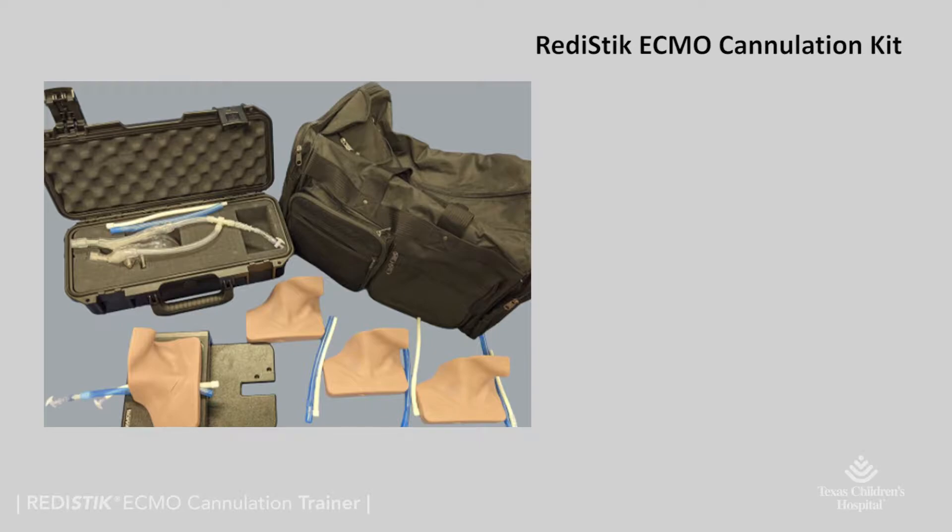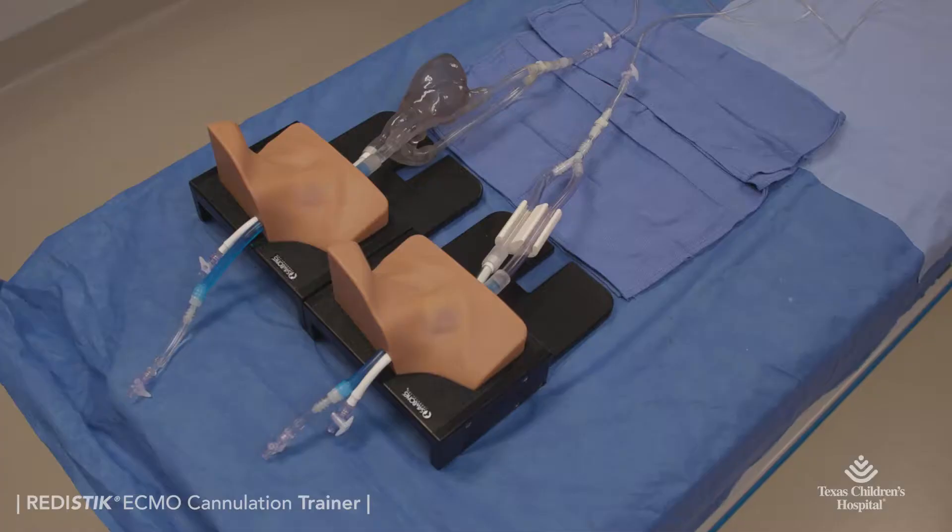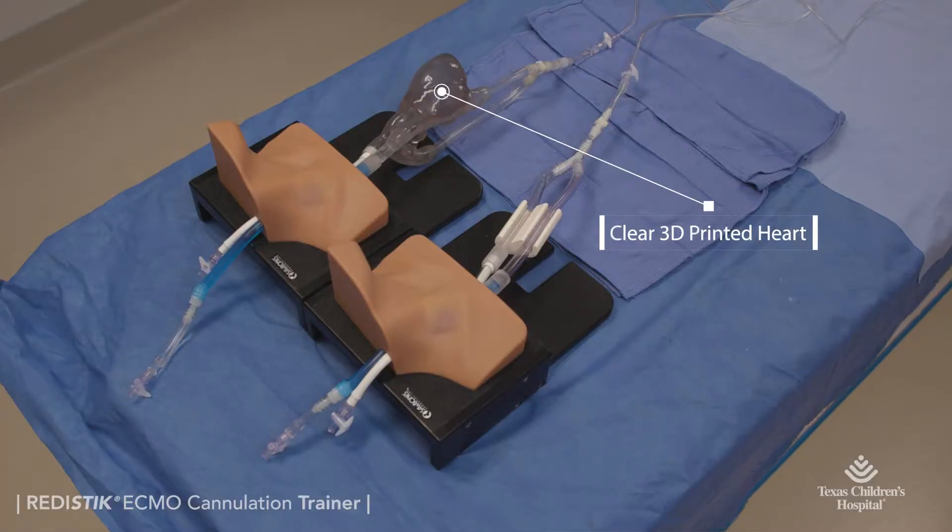The ReadyStick ECMO cannulation kit includes neck simulators with vessels, an extra set of vessels and fittings, trainer base, stain-resistant color tabs, all in a portable carrying bag. They are available with or without a clear 3D printed heart, both options providing a closed-loop system and quick setup in less than 10 minutes.